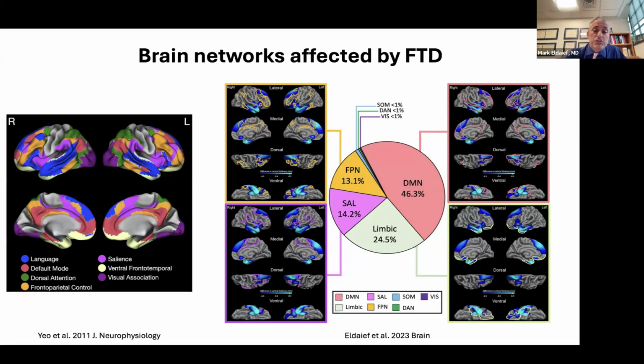And in this way, we can look at what parts of the brain talk to each other, and we call those different parts that talk to each other a certain network. So here, the brain is divided up by color into the different networks that comprise the brain. Basically, everybody has more or less the same networks. My network might be in a slightly different area than yours, but not a very different area. More or less, people have networks in the same area.